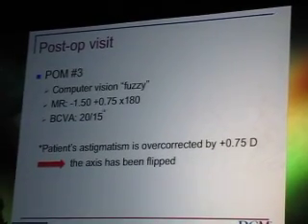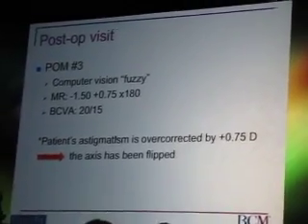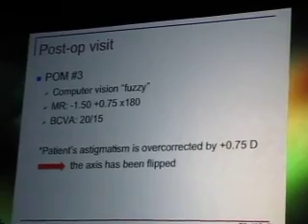Postoperatively, he said his vision's fuzzy. He has 3/4 of a diopter of against the rule astigmatism. And I flipped his axis by 3/4 of a diopter. I've had fun chatting with him since.